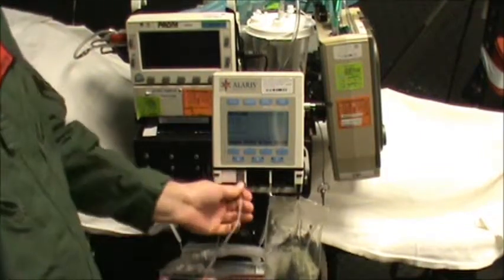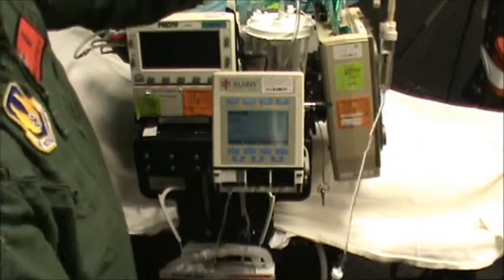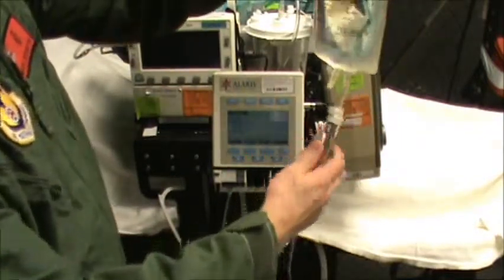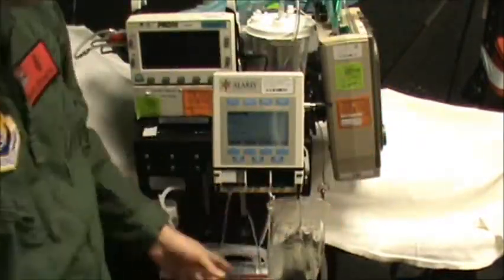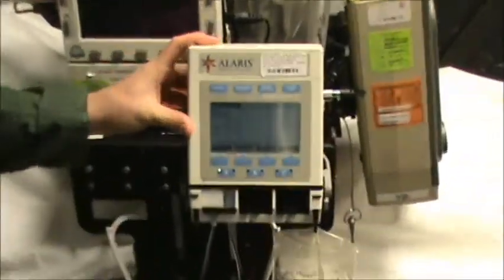You're just checking from the cartridge back to the IV bag for any kind of an occlusion. Once you've recognized where the kink is, you correct it and then go ahead and hit start again.